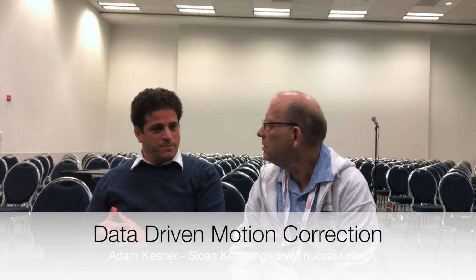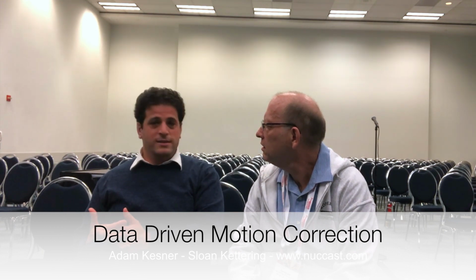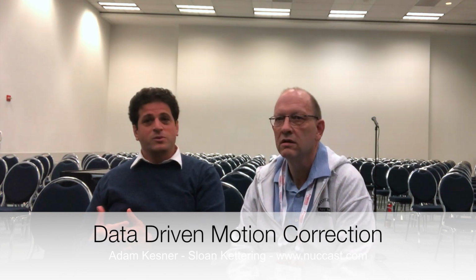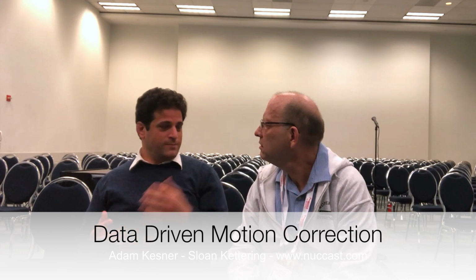So motion is an inherent problem in PET imaging, and it's a particular problem. In the early days when PET was developed, people didn't think so much about motion in the 80s and 90s because the resolution of PET was still developing. Yes. But in the 2000s and 2010s, we have very high resolution PET technology. And if we want to utilize that technology, particularly in thorax imaging, we need to find a way to deal with patient motion. Right.